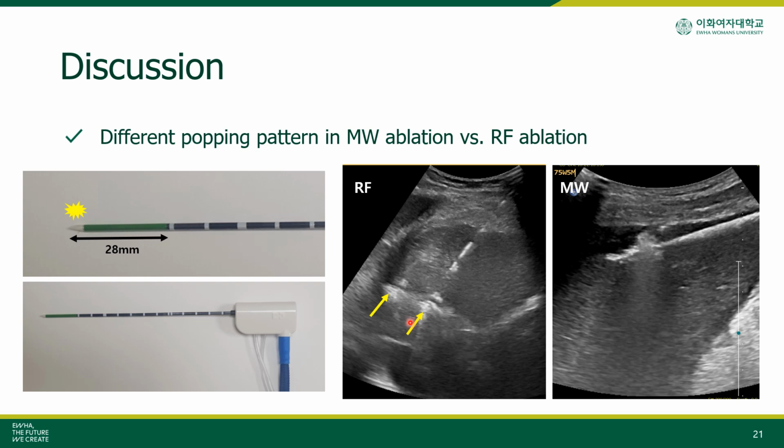In contrast, in microwave ablation, the energy is focused on the distal two-thirds of the active tip of the antenna, situated farther from the hepatic capsule than in RF ablation. Therefore, the capsule is less susceptible to rupture during microwave ablation, providing an advantage for the low-power protocol, as seen in the parallel approach.